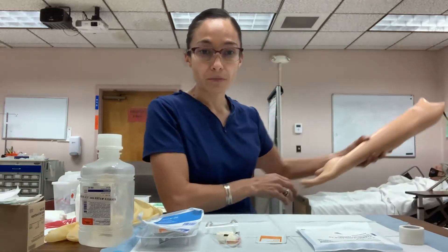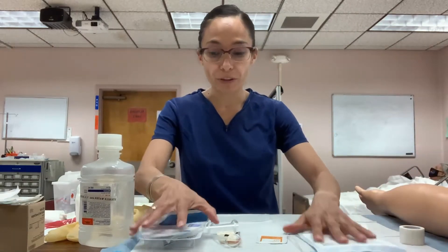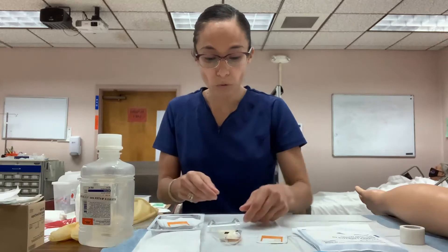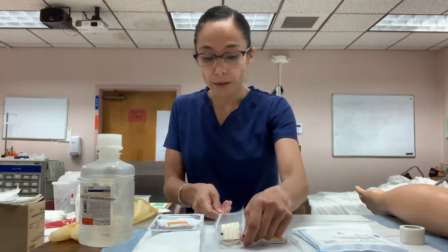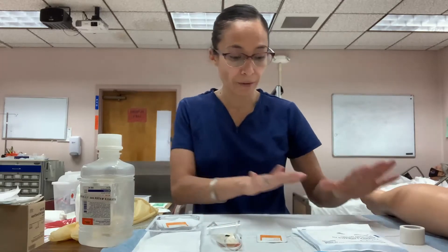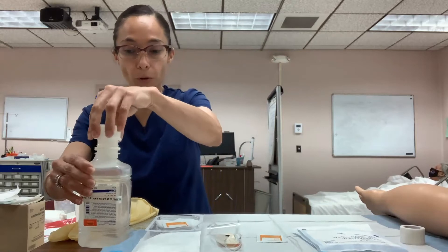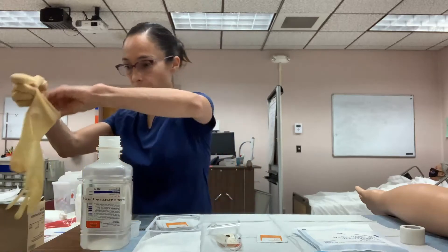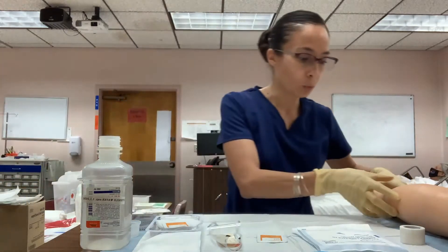Once you have gathered your supplies, go to the patient's room and perform hand hygiene. You want to work on a hard surface area. Wash your hands and then set up your field — open the staple remover, have the steri-strips ready, and open the normal saline. Then put on your gloves and approach the patient.